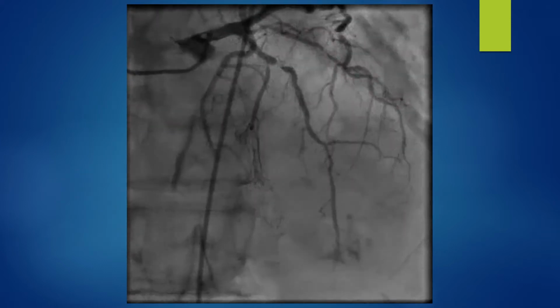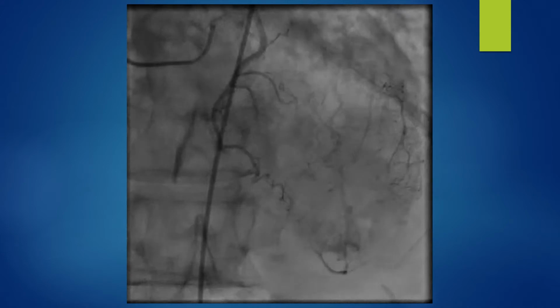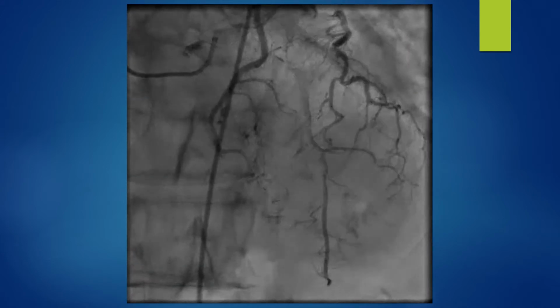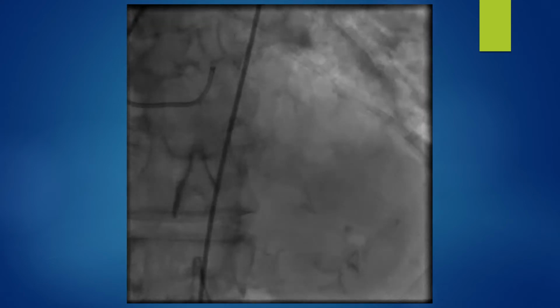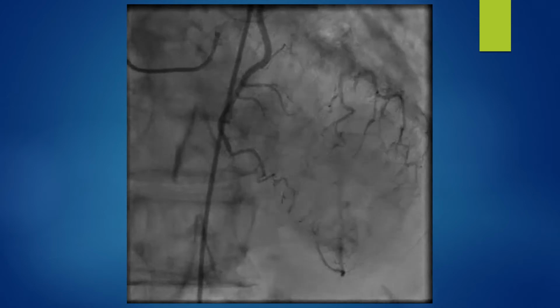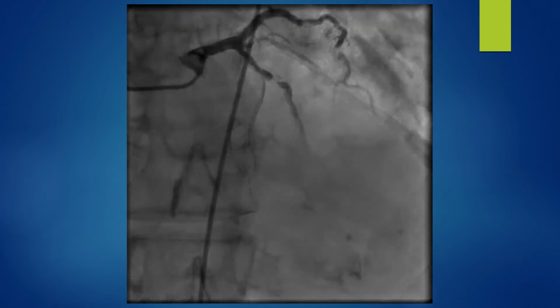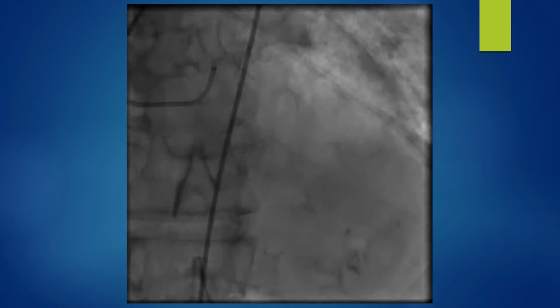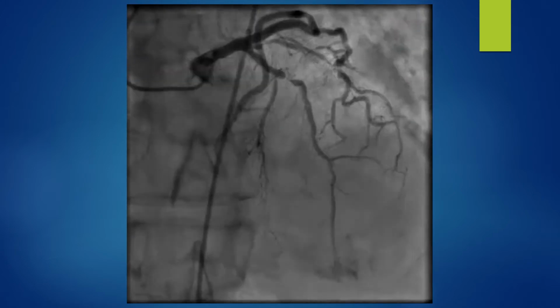This is the first angiogram picture. We got a 6 French sheath in the groin. She's a short lady, and therefore we decided to go groin rather than right radial. And I personally don't like left radial because it's hard on my back and it is associated with high radiation for me.